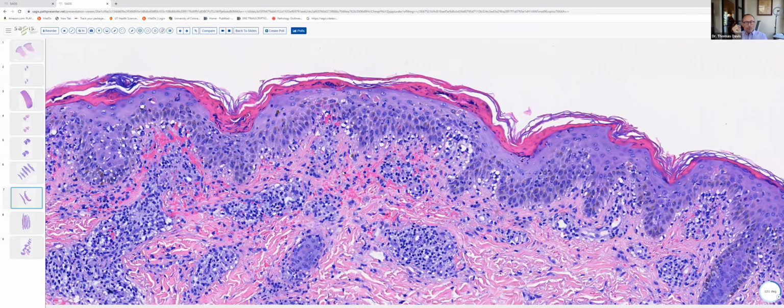With erythema multiforme, you do get a perivascular infiltrate of lymphocytes like we do in Mucha-Habermann disease, but the inflammatory infiltrate is confined to vessels of the superficial plexus, and the cornified layer is different. In EM, we get a basket weave cornified layer. We do not see mounds of parakeratosis containing neutrophils. And those two things are what distinguish erythema multiforme from Mucha-Habermann disease or PLEVA.